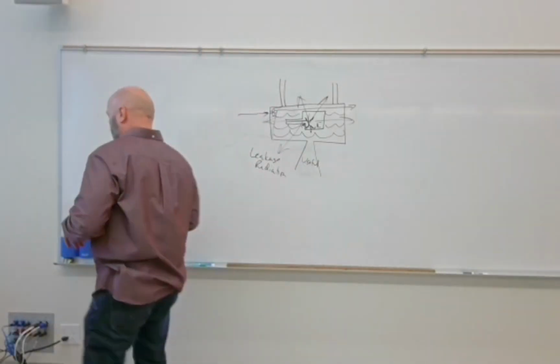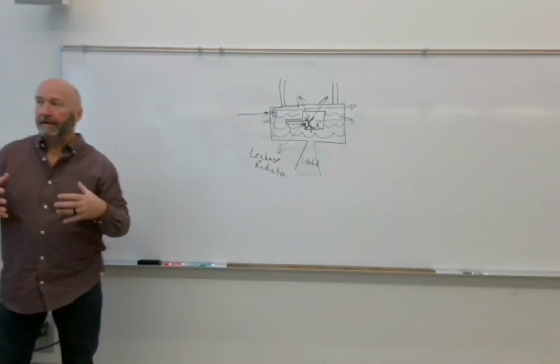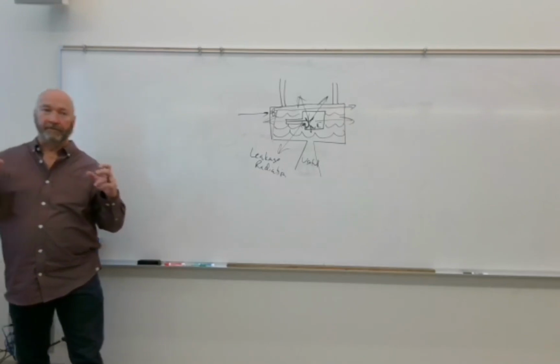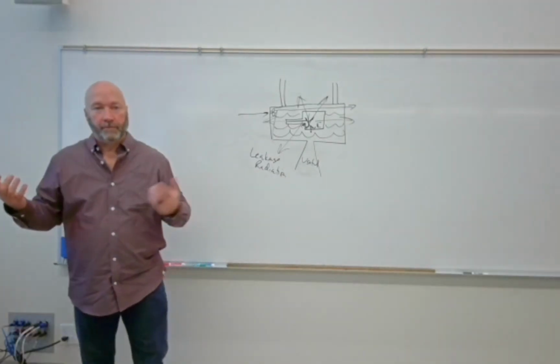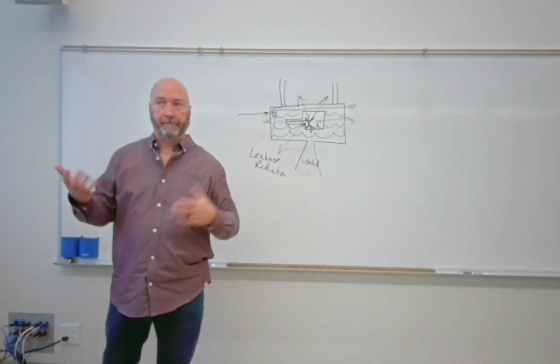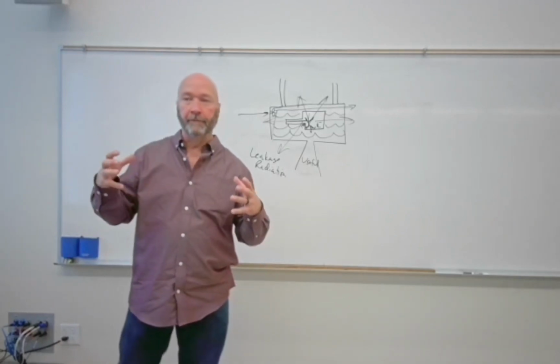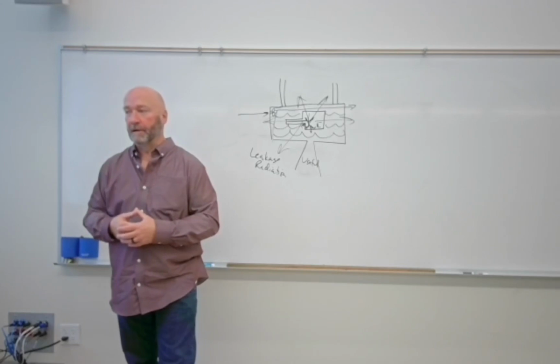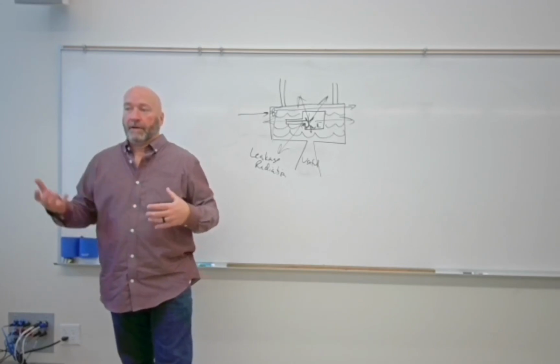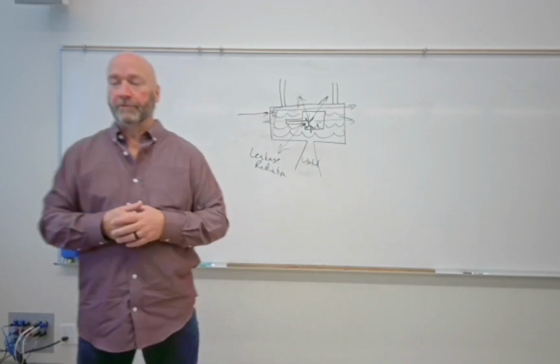All right, so inside the X-ray tube, or the X-ray tube itself, what we call the thing that holds the vacuum in is an envelope. I'm not 100% sure why. The tube, to me, is better, or at least just as good. But anyway, the tube itself, the glass itself, is what we refer to as an envelope. So inside the envelope, we have the cathode, we have the anode, and we'll talk about the individual components of that.